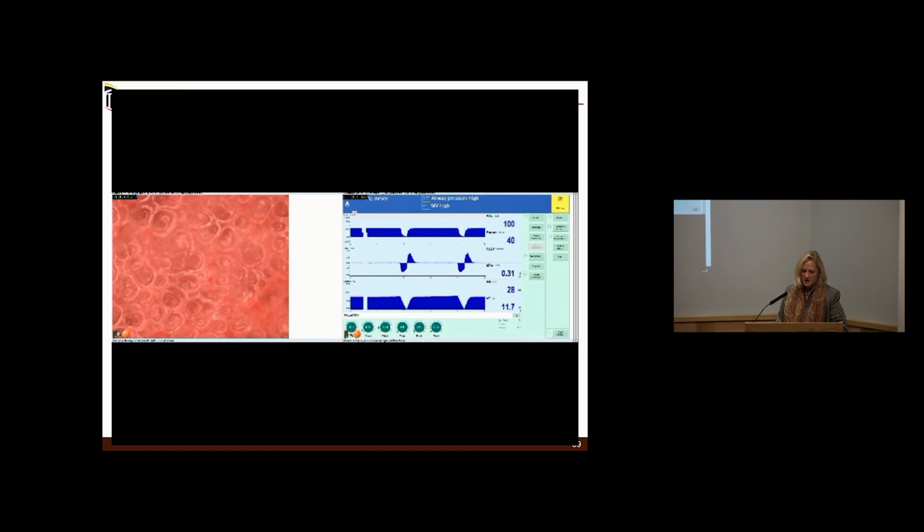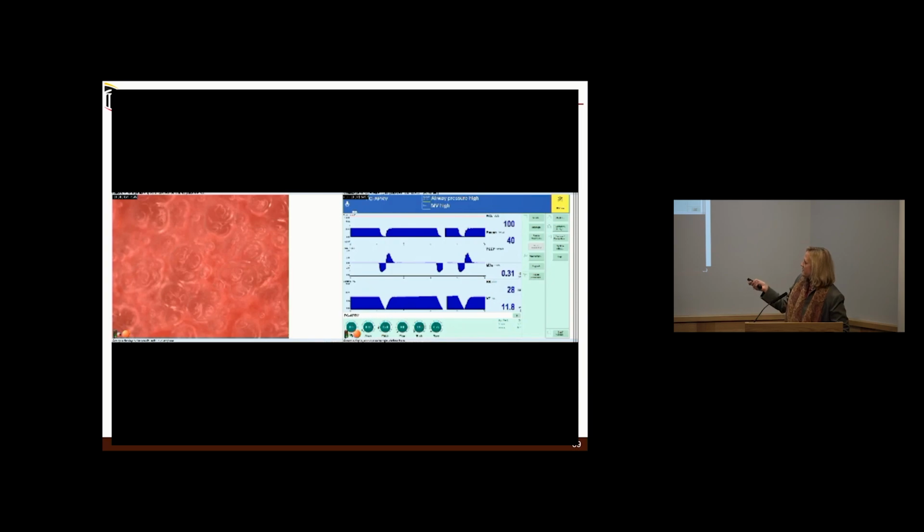And now here, this is 50%, okay? And do you see what I mean here by that? There's my cross, right? That's 50%. So do you see how the termination is at the halfway point of your expiratory flow? That's really easy to spot. As soon as you walk in, you don't know exactly what the T-low needs to be. You know it needs to be shorter, okay? And then here's 75%, almost no change in alveoli. It's a little grainy because it was on a wrap.